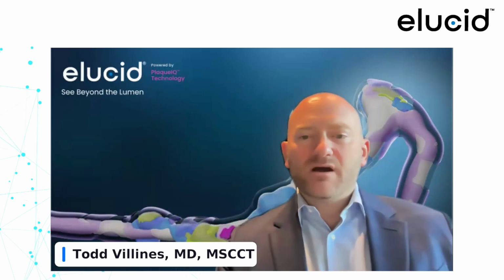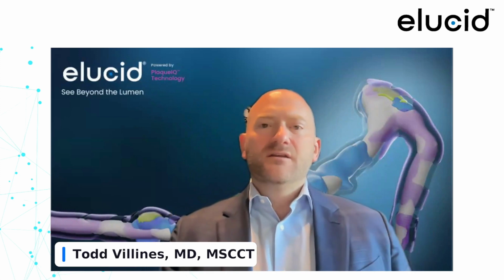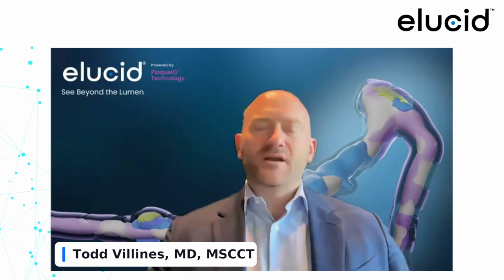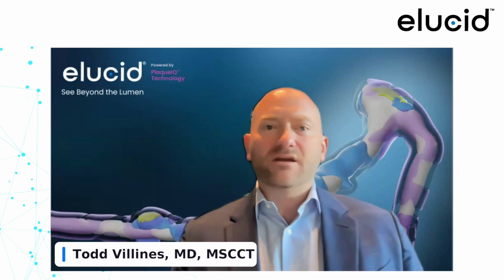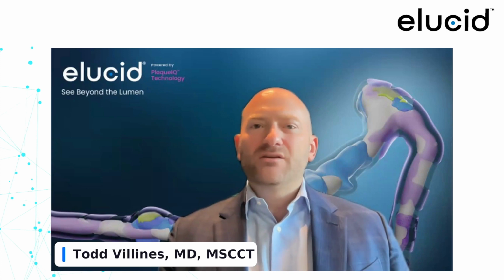I am very thrilled to be joined by a panel of expert speakers. I think all of us are aligned in the field around the importance of quality imaging. I think all of you are aware that in the 2021 US multi-societal guidelines for chest pain, as well as international guidelines, coronary CTA has been elevated in its recommendation for patient care. For example, in the US guidelines, it was the only non-invasive test given a class 1 level of evidence A recommendation. What we've seen as a field is exponential growth, with centers that were previously doing coronary CTA seeing expanded volumes and increasing demand for the utilization of this great technology, as well as new growth in sites starting cardiac CT programs around the world.